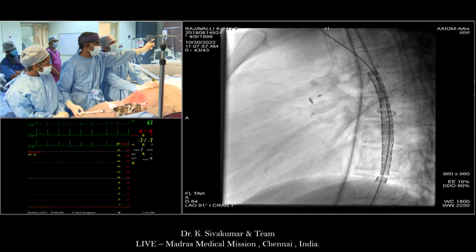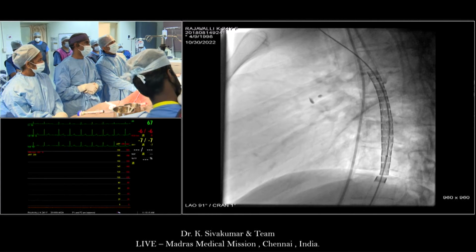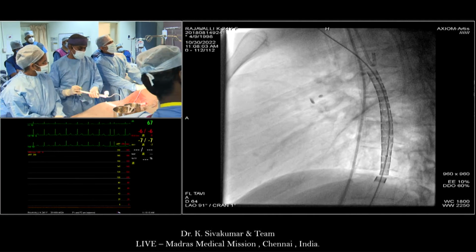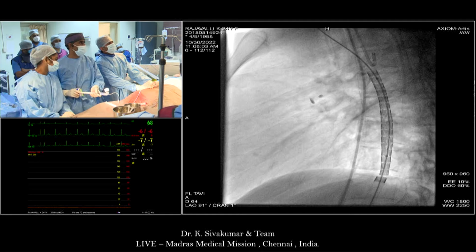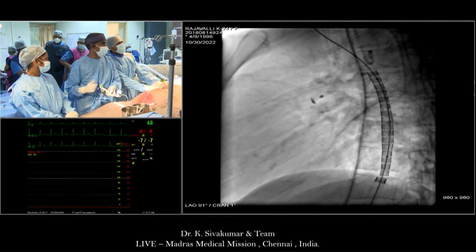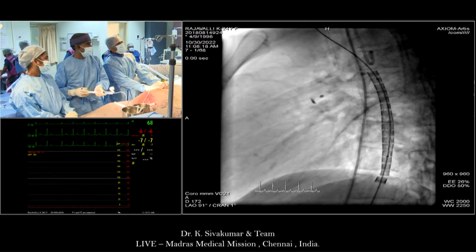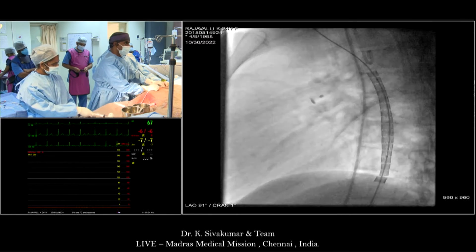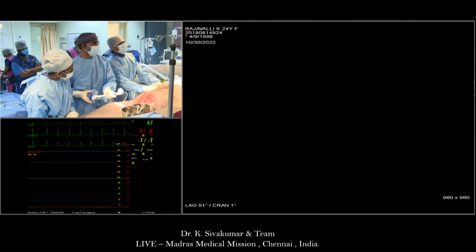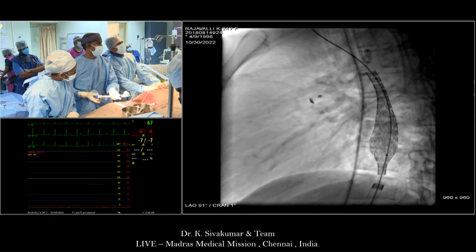Okay. Now pull the pigtail up. Pull out. A little bit above. Just come above. Enough. Enough. And also, do you want to move the sheath down a little bit as well? I'll show you. The balloon is well distal. I have only the stent there. You see that? The balloon is far more distal. Keep going though. So tell me the number, sister. Keep it pushed up, Vishnu.